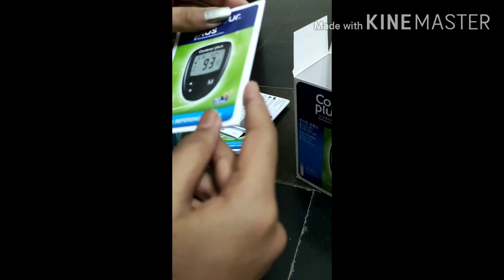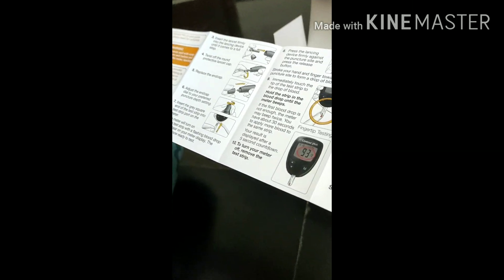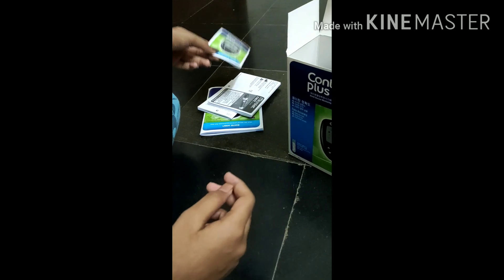Next is the quick reference guide. You can see here how to use this device. I will explain how to use this device — it also shows you step by step how to use it.